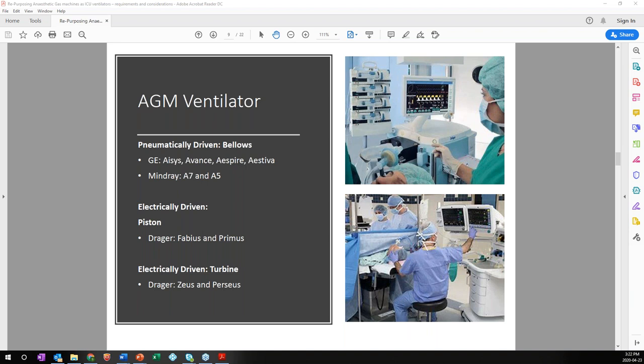This is a very important principle of operation. And if it's not well understood, it could lead to significant harm to the patient and possibly death if the ventilator is inadvertently disengaged and the patient is left in spontaneous mode without a competent respiratory drive, or they get switched into this mode and the APL valve is cranked up too high.